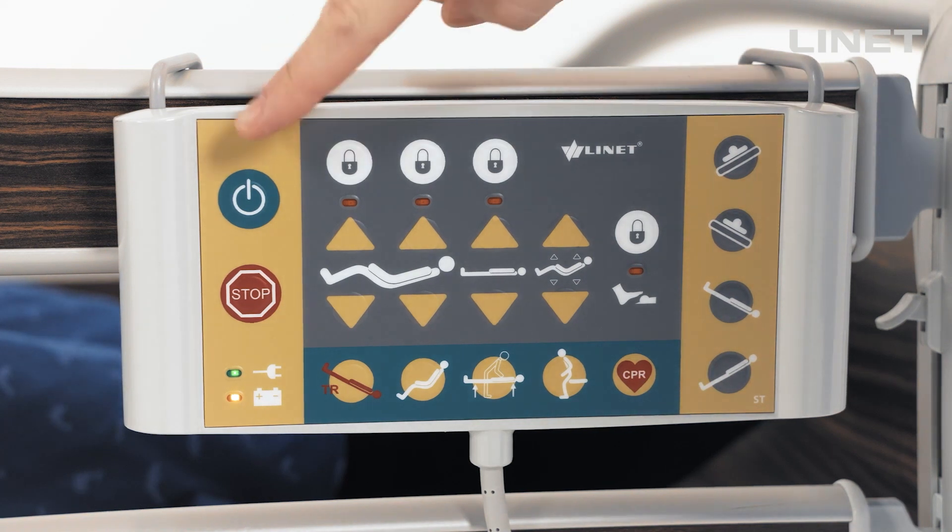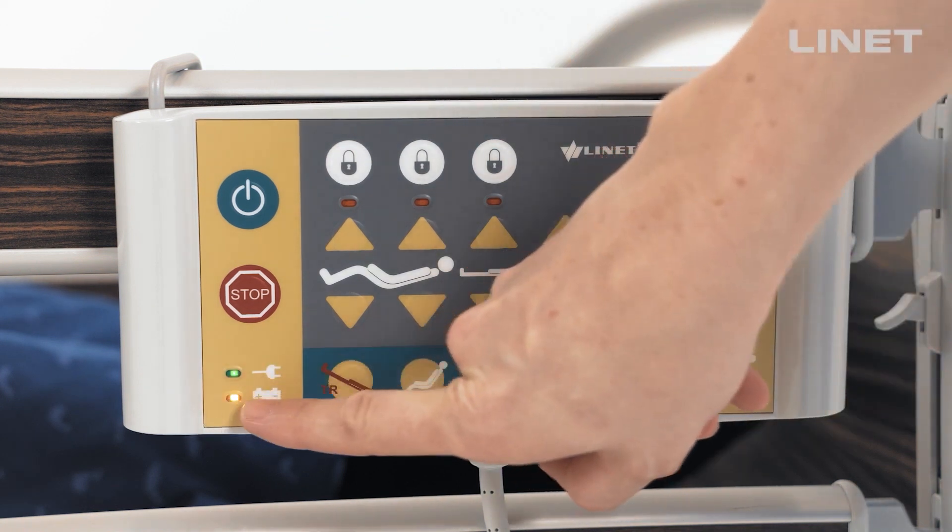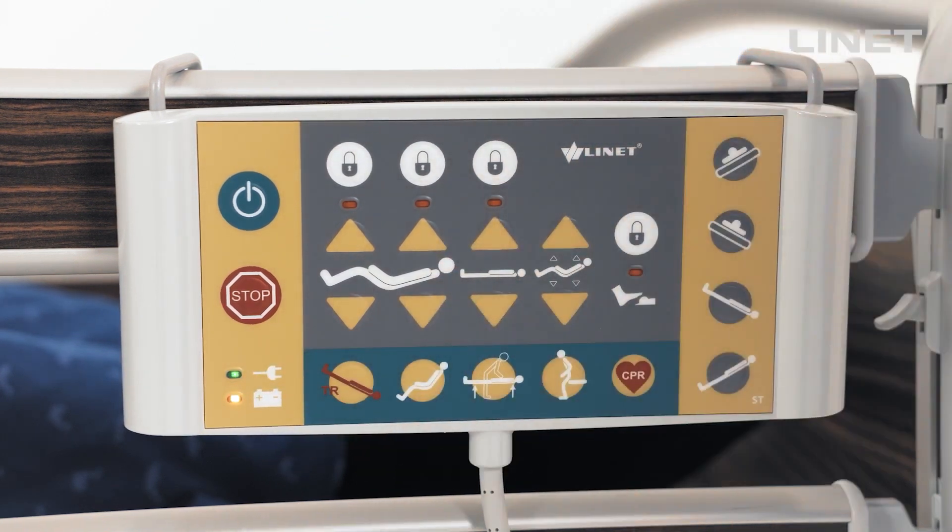The ACP contains the go button for activation of the bed and the stop button. There is an LED to indicate if the bed is charged or if it is in the mains.